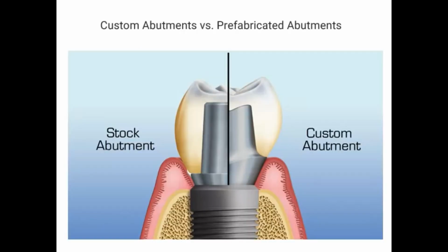Abutment selection: custom abutments or prefabricated abutments. A custom abutment is one in which the practitioner must make either a tissue or a bone level impression of the implant with the help of a transfer impression coping. A prefabricated abutment is machine made, seated and torqued on the implant.